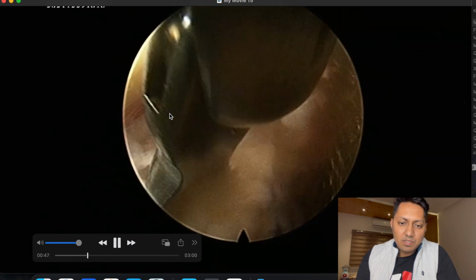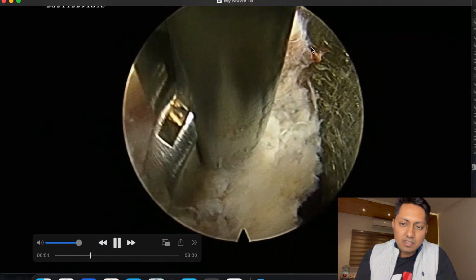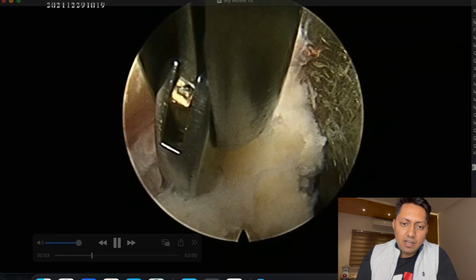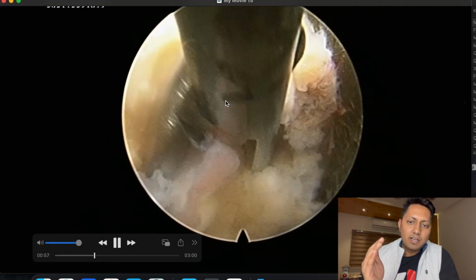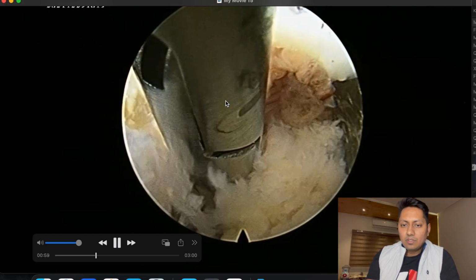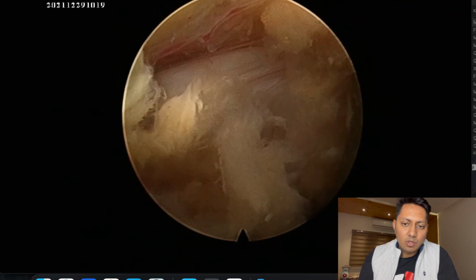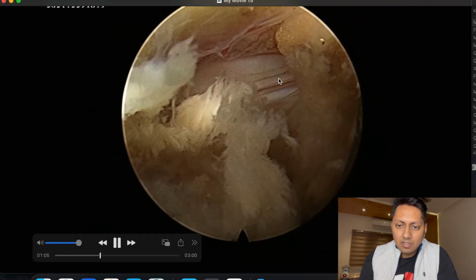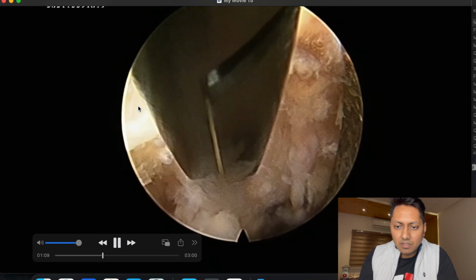Again we are doing the same surgery from the right side. So this is the foot end of the patient, this is the head end of the patient, this is anterior, and this is towards the roof. I use my articulating curette to detach the annulus from the lower end plate, so that makes our job easy. And you can see how well this L4 traversing root has been decompressed now.